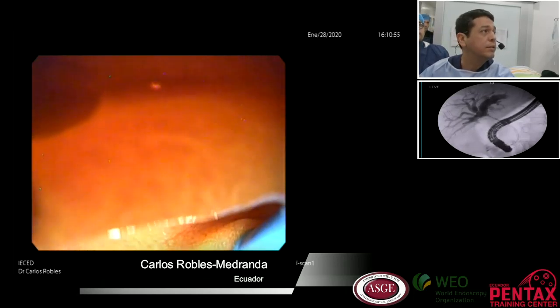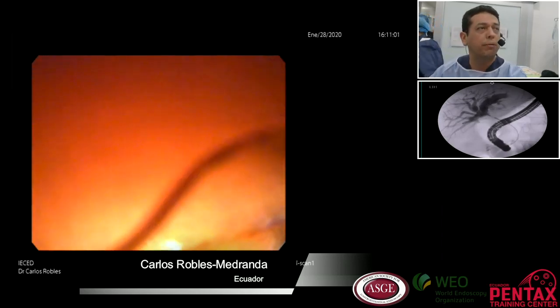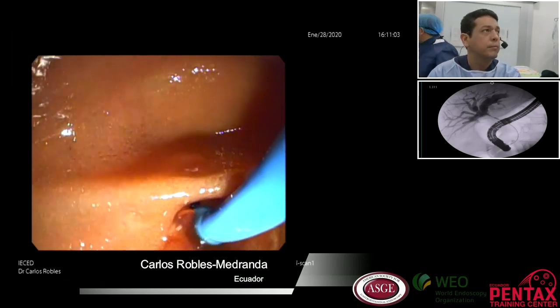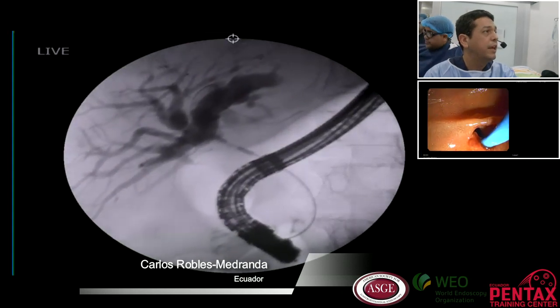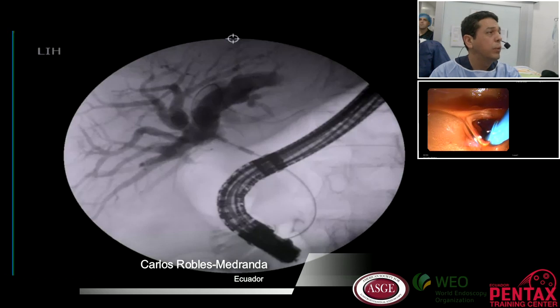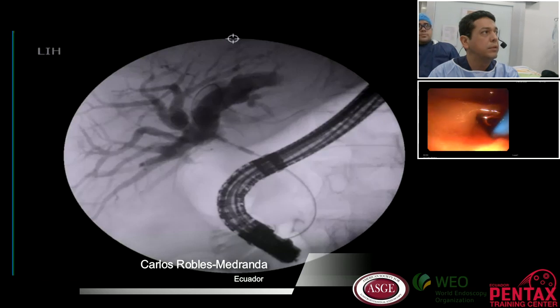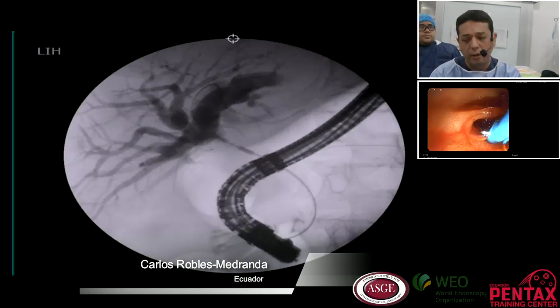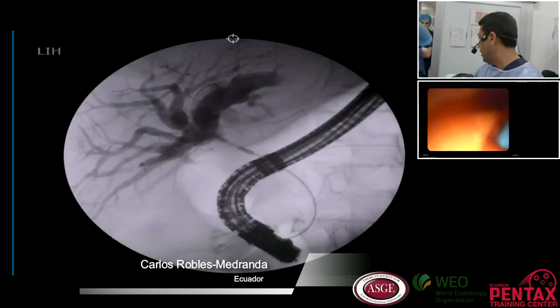Okay, so this is the catheter at fluoroscopy. ¿Podemos ver la fluoroscopía, por favor? So, and this is the area between both segments that we can see at the X-ray. So this is the area to be treated initially, okay? We will perform the radio frequency. I don't know if we have a camera just to show this.